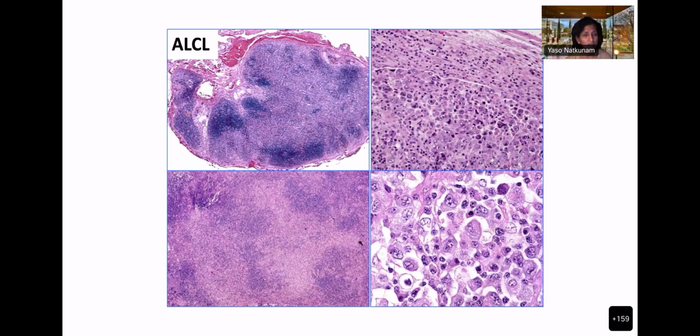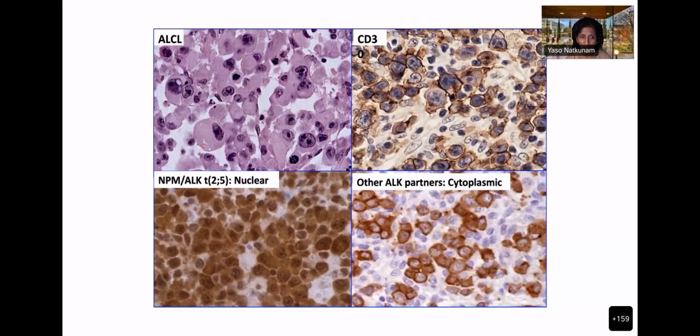The lymph node at low power tends to look pink. So you can see that too. We saw it in the first case I showed you. It looks very, very pink. And then this pleomorphism, which the case I presented does not have. So again, large atypical cells.